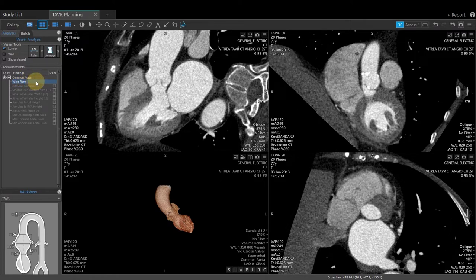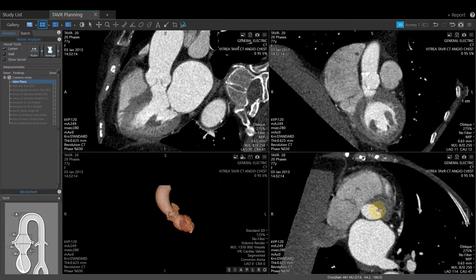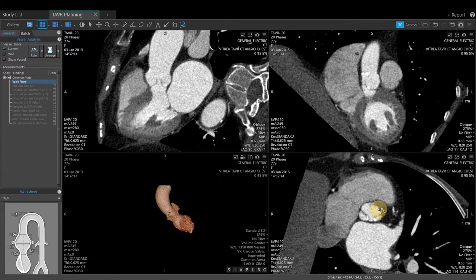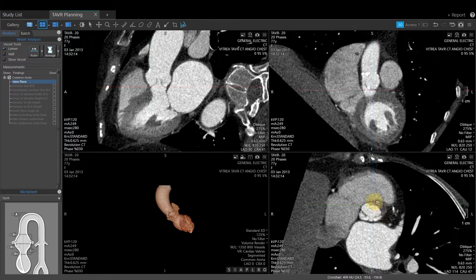Now that valve plane has been selected by left-click, note the crosshair has disappeared. If you would like a crosshair reference while navigating TAVR, hold down the left ALT key on the keyboard. Notice that while rolling the center wheel without ALT, there is no crosshair. Holding the left ALT key displays a crosshair, and the associated measurement tool will be available after releasing the left ALT key. The valve plane tool — the hand with the box — is active when ALT is released.